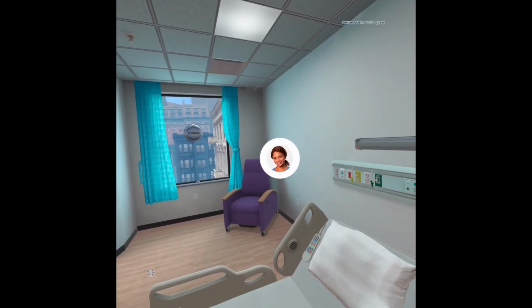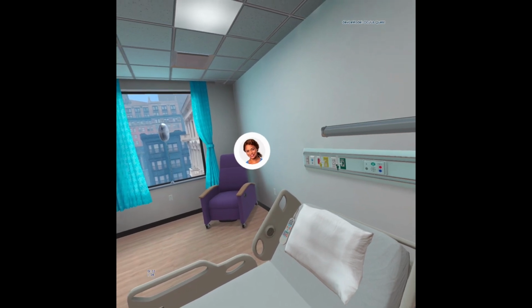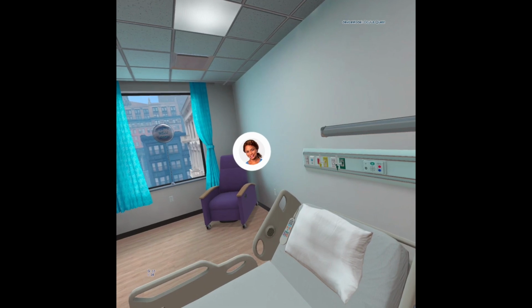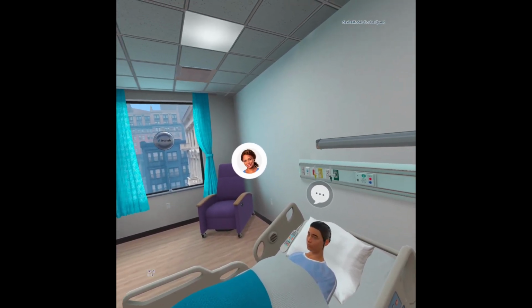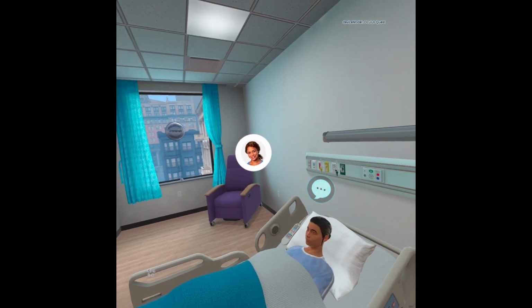Well done demonstrating appropriate techniques for transferring a patient from bed to wheelchair using a gait belt. These practices improve patient safety and reduce fall risks. It's time to try it on your own. You'll be scored for this, and I'll be here if you need anything, but you will lose points if I have to help. Select these buttons whenever you need them.